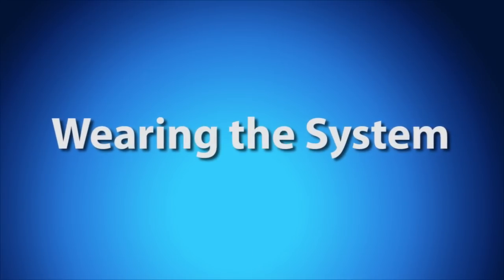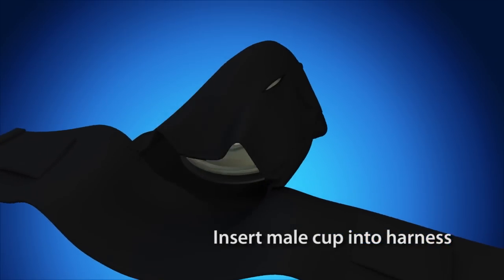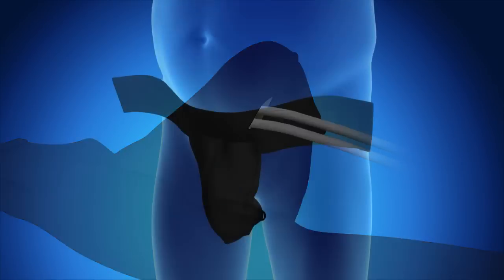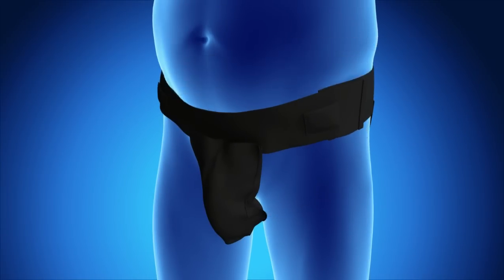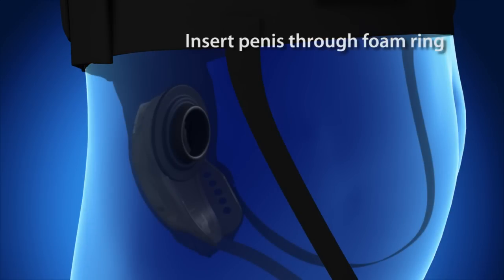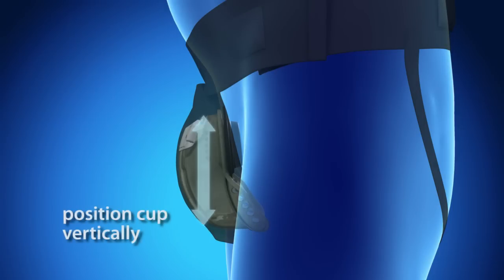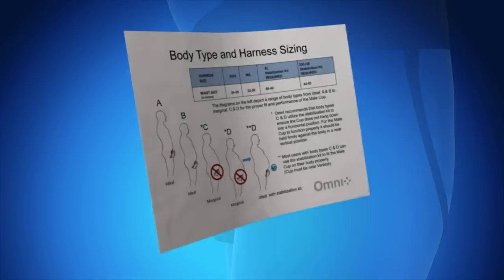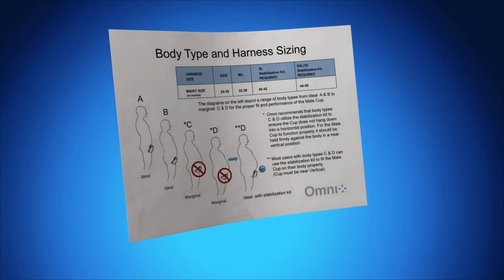Wearing the system: Insert the male cup into the pocket in the brace or harness before or after wearing. Feed the hose through the small hole at the front of the harness. Feed the back portion of the harness through the legs. Fasten the velcro straps on each side of the waist. Insert the penis through the foam ring of the cup. Ensure that the cup is being held in a vertical position and is snug against the body. If the cup is not positioned correctly, the sensors will not be able to sense urine and will not activate the pump. Please consult your sizing and body type chart for more information on how to properly wear the cup and harness or brace.